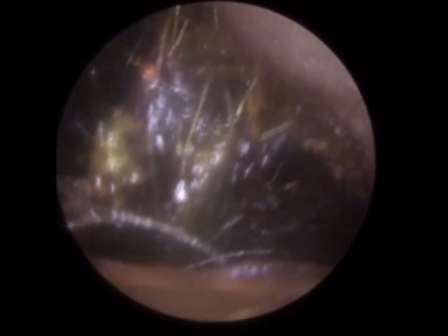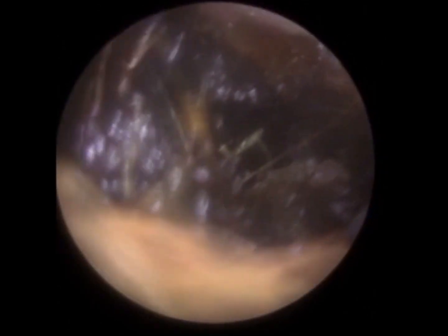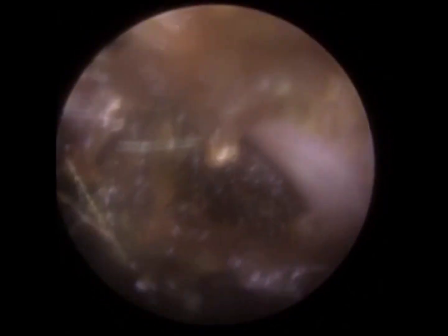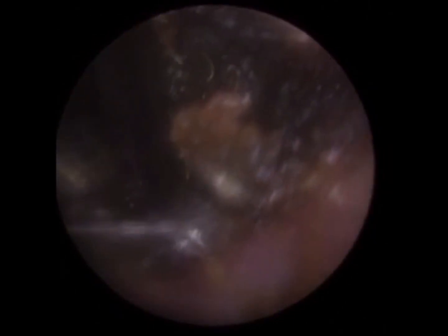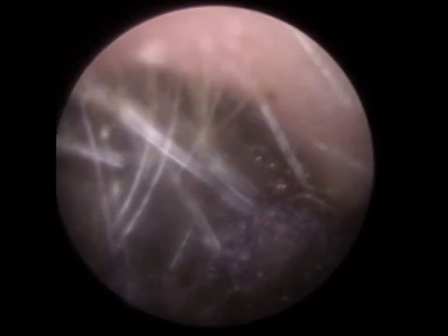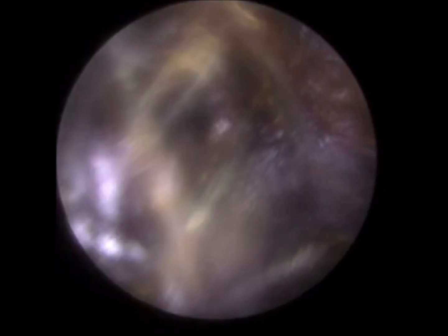In some respects, it might have been easier to remove if the wax was as hard as it was in the first ear, because at least that way the objective is just to get behind this lodge of hard wax, and as you bring the instrument out, because that wax is rock solid, it also comes out with the instrument. When you've got wax like this, which is a bit sticky and soft, a bit like margarine or butter, whichever instrument, so we're using a Jobson horn at the moment, or an ear hook, it just slices through, and that's the issue.